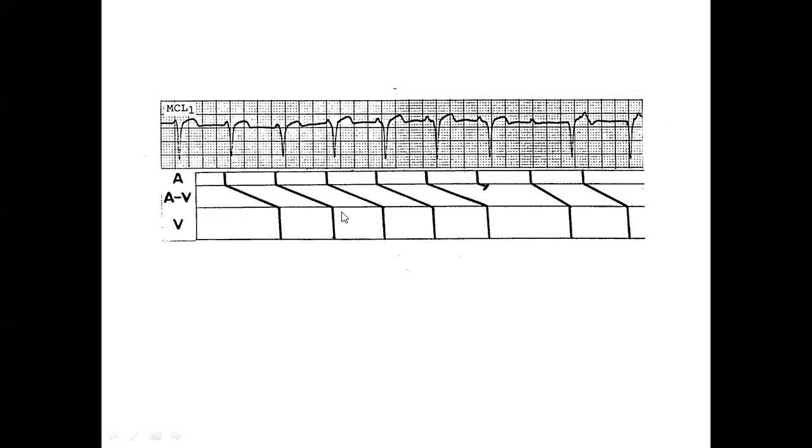So this P is conducting not to the last one, but to this one. This P not to this one, but to the next one. Again, think of this city bus dispatcher. Are you comfortable with it?